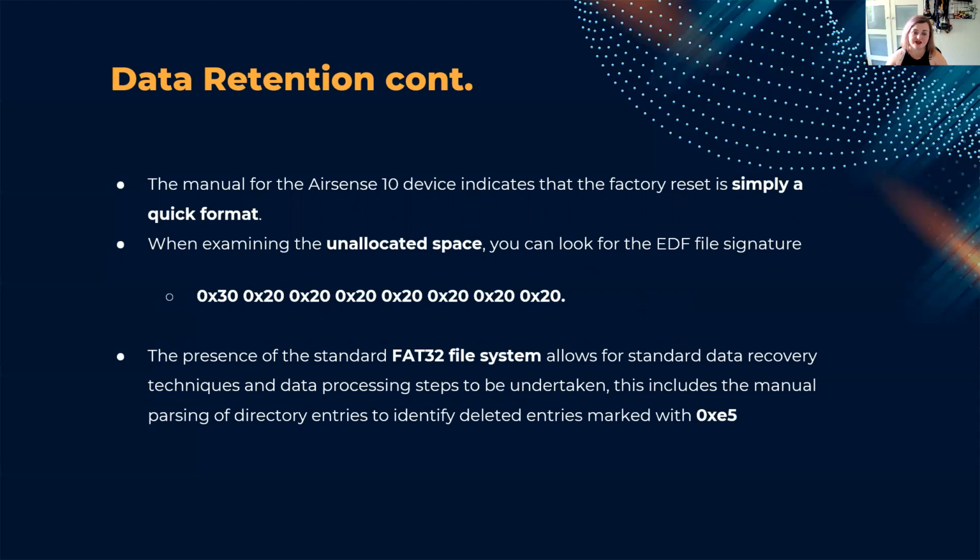If you've done digital forensics, you know that there's a large chance on FAT32 that you'll be able to recover the files. When examining the unallocated space, for one thing, you can actually look for EDF file signatures, which you can see below, and you can go search and recover those files.